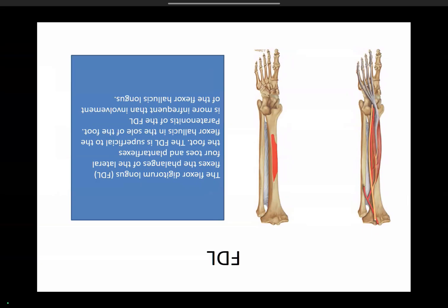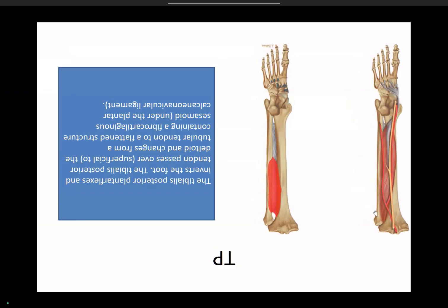Flexor digitorum longus has a big origin in the middle one-third of the tibia, divides into four slips, and inserts into the second to fifth toes. Tibialis posterior is a bulky large muscle, arising from the posterolateral tibia and fibula, lying medial to the neurovascular bundle. It has multiple insertions — the most predominant on the navicular bone — but also gives slips to the cuneiforms and the bases of the second, third, and fourth metatarsals.